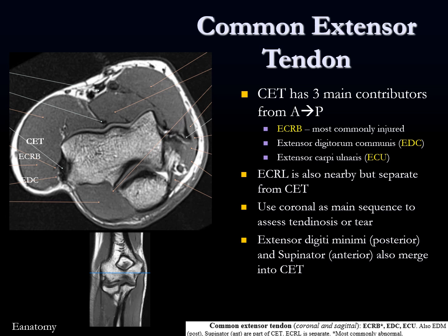On axial images, here's the common extensor tendon origin showing the ECRB and EDC. The ECU would also be nearby. Not as important for routine reading to say what each individual structure is, but just know that the common extensor tendon origin is at the lateral epicondyle, and you can reference what exactly those tendons are as needed.